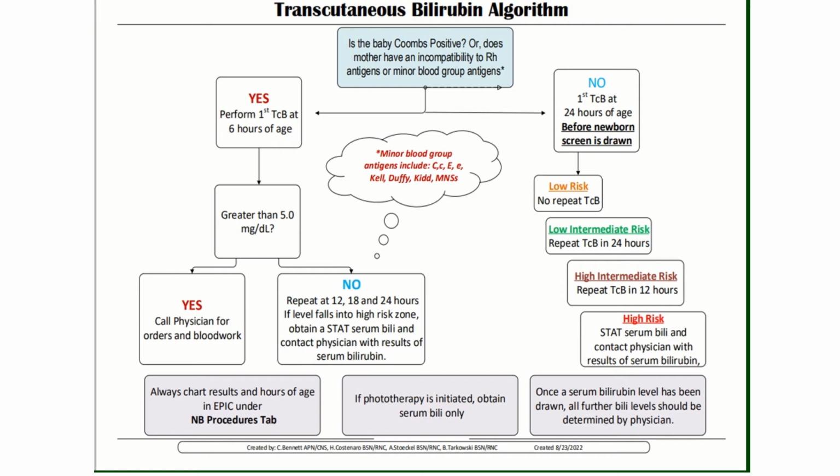It's important to note that once a serum bilirubin is drawn, the physician should determine how all further bili levels should be obtained, whether that's a serum or transcutaneous. Additionally, once a newborn is started on phototherapy, all bilirubin levels should be obtained serum.